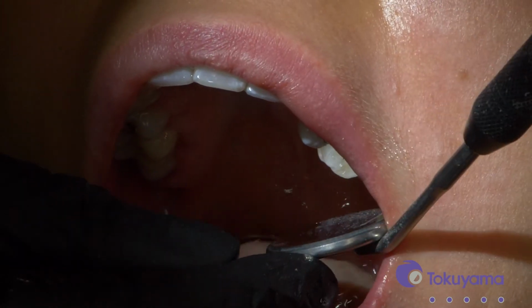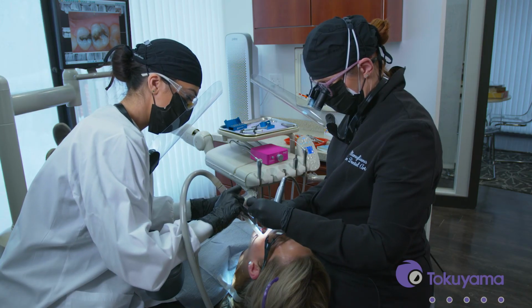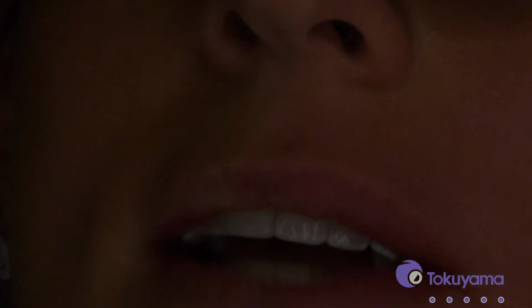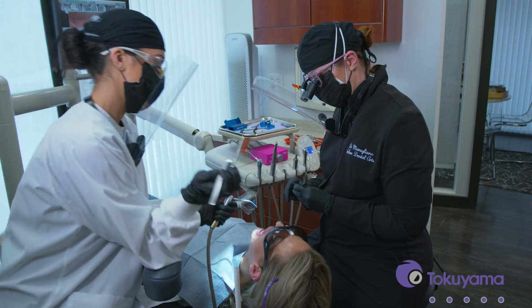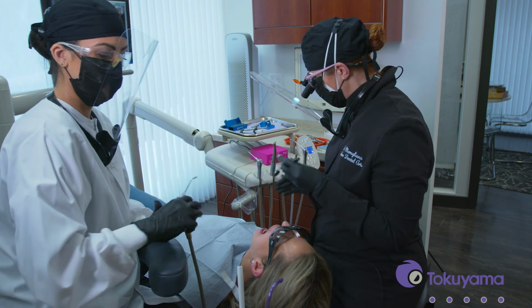Occlusion again. A little bit more. There we go. How's that feeling, Sarah? Feels really good. Is there any high spots? Let's check one more time. Excellent. And bite down. Looks great. Okay, we just need to polish.